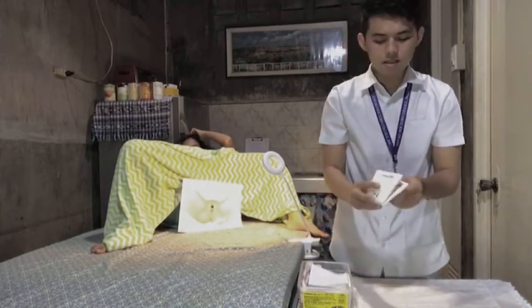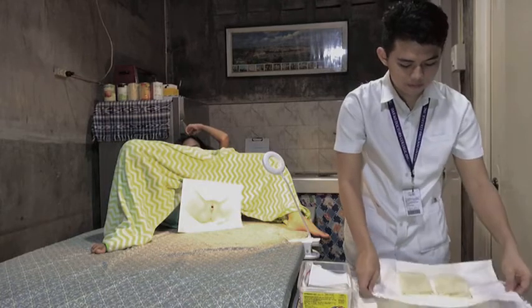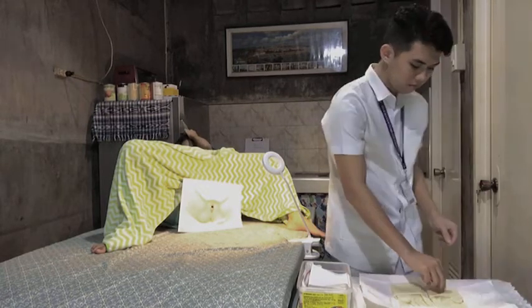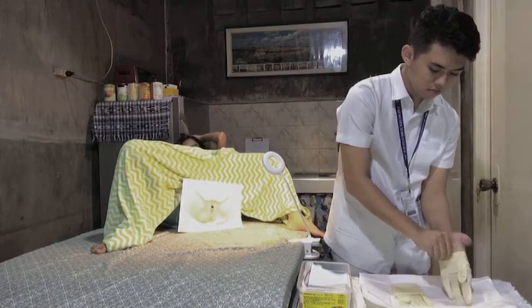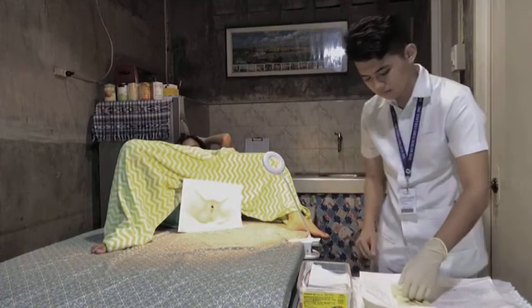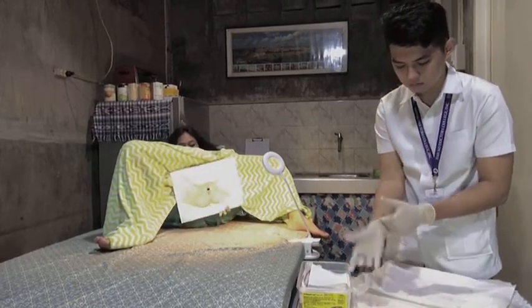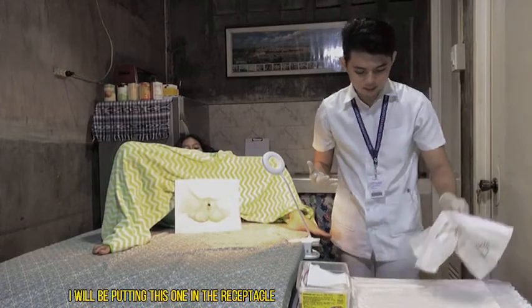So just open this one and start the open gloving. So I'm now sterile. I will be putting this one into the receptacle.